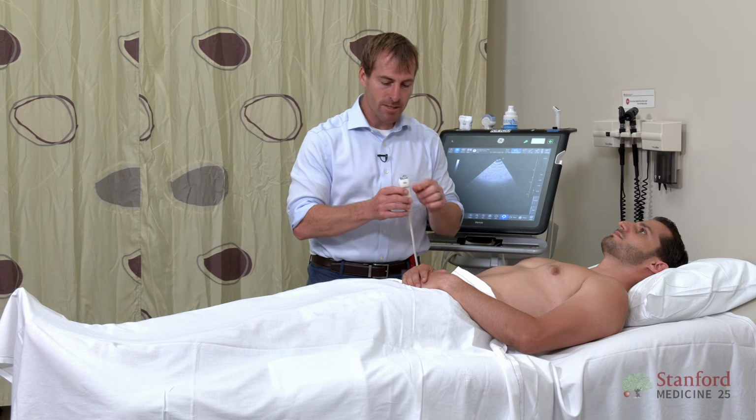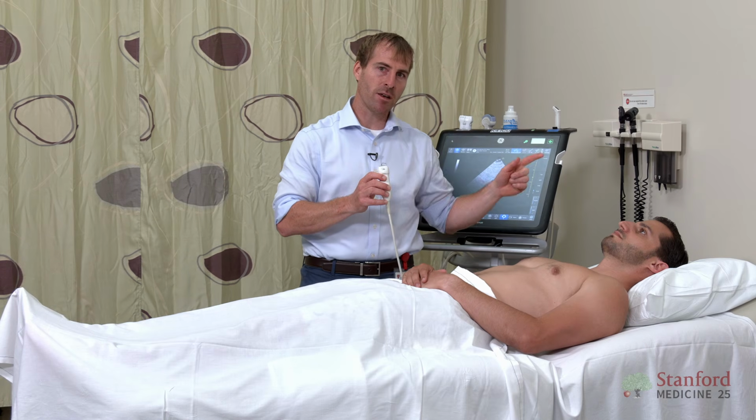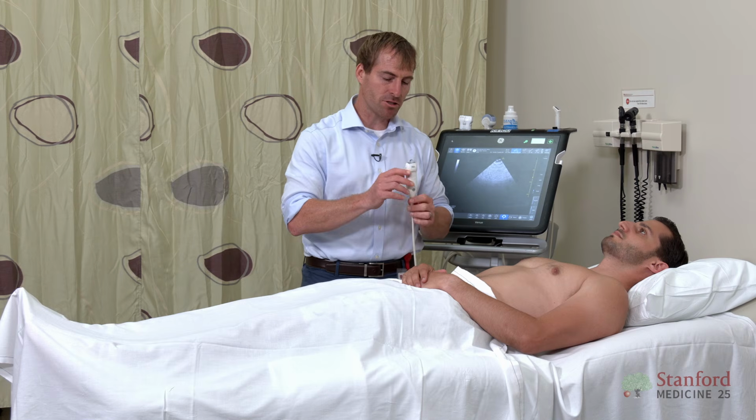It's not wrong. I'm going to place the probe indicator, that's your dot side of your probe, pointed upwards towards the patient's chin.